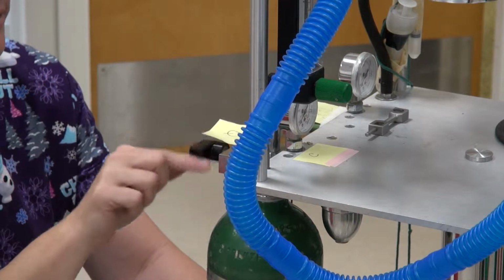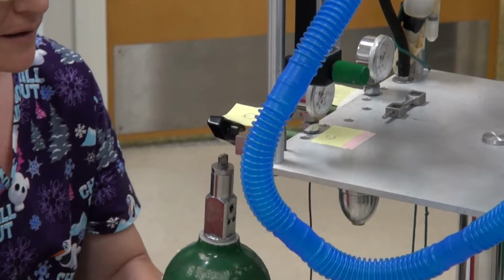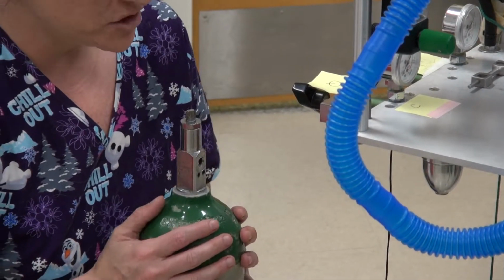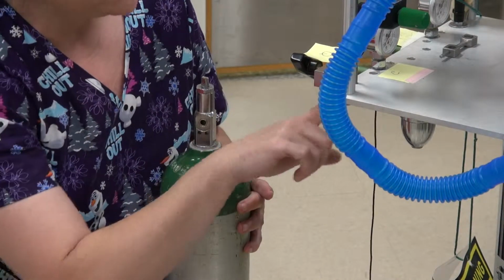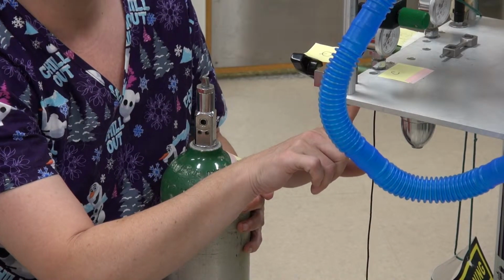So what I would do is take off my tank slowly, right? Do I handle these with care? Yes. So handle it gently. There's going to be 3 holes right here. 1 big hole, 2 small holes. They are going to line up with the holes on your anesthesia machine, all right?